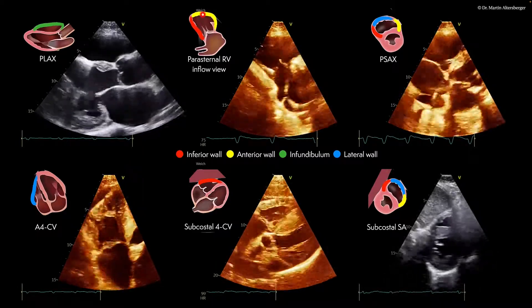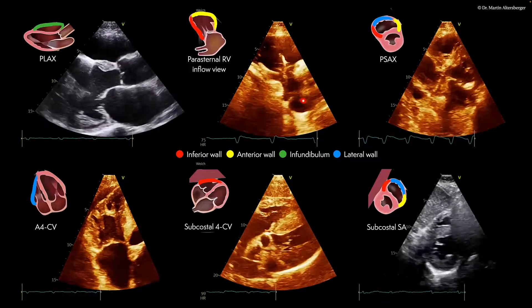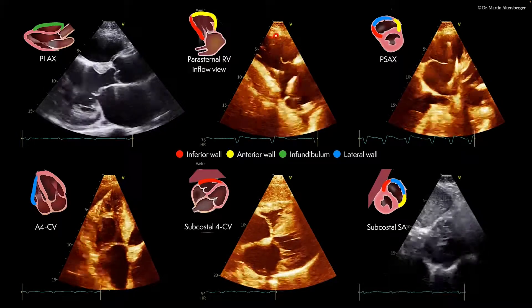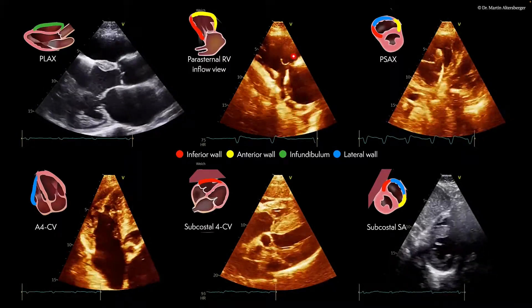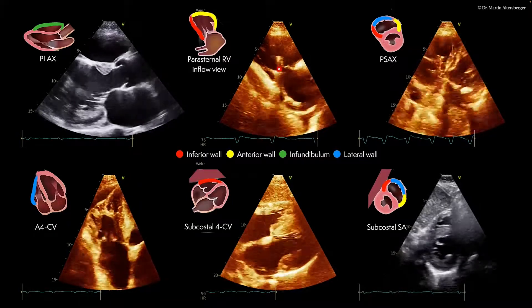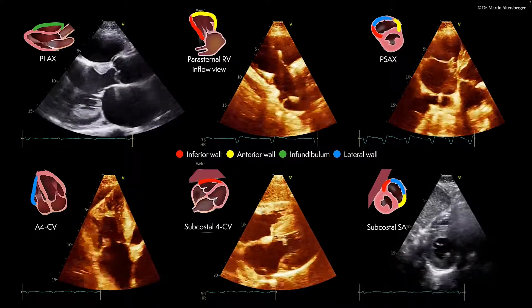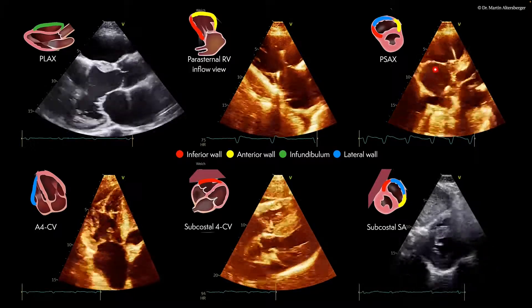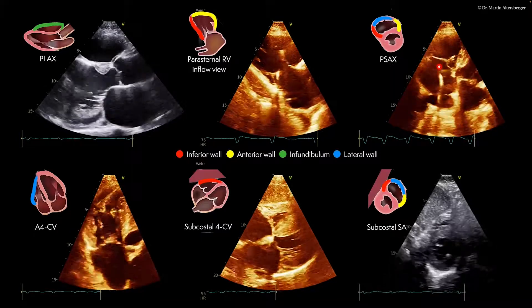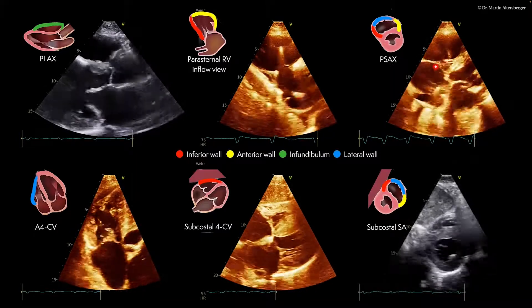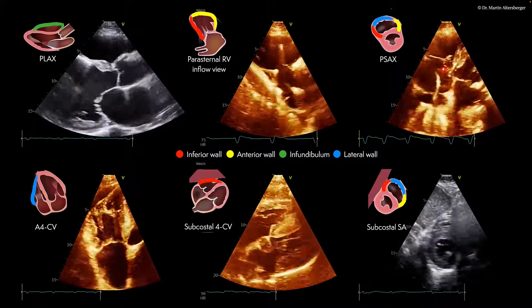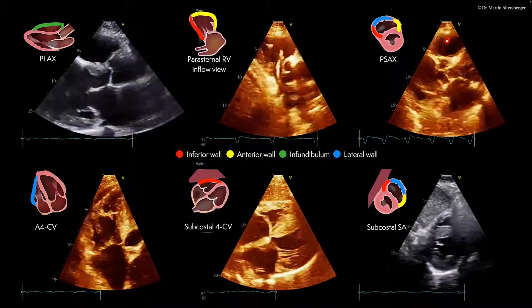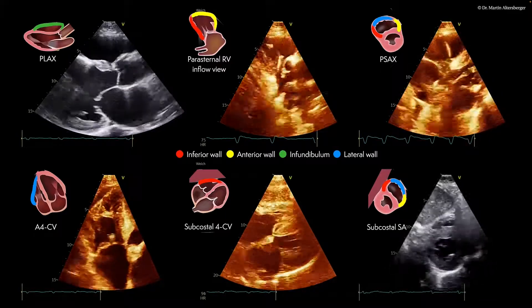In this view, we have the parasternal view with the inflow of the right ventricle — this is the right atrium, this is the right ventricle, and we do see the right ventricle is definitely dilated. Furthermore, there is a problem with the tricuspid valve; we will discuss this patient a little bit later. We can see parts of the right ventricle and the tricuspid valve — the pacemaker lead is hypermobile. The right ventricle is dilated and the function is reduced as well.